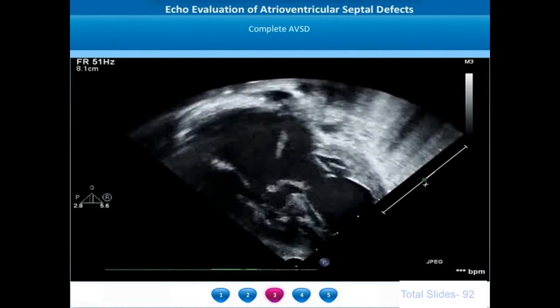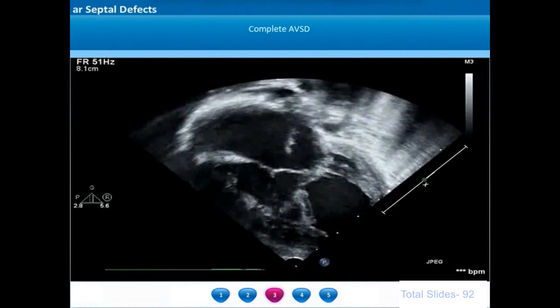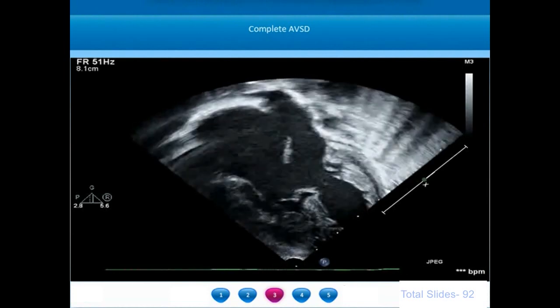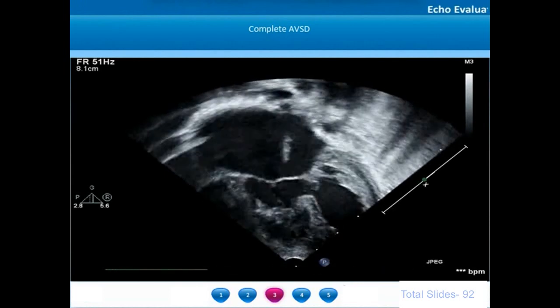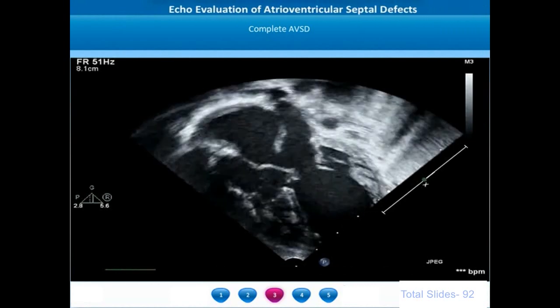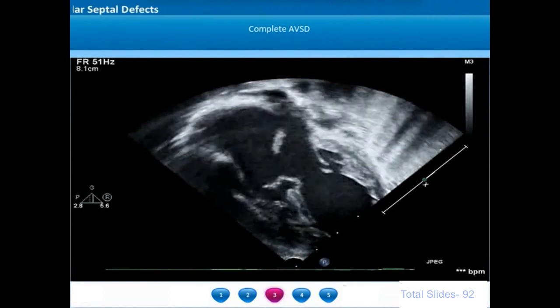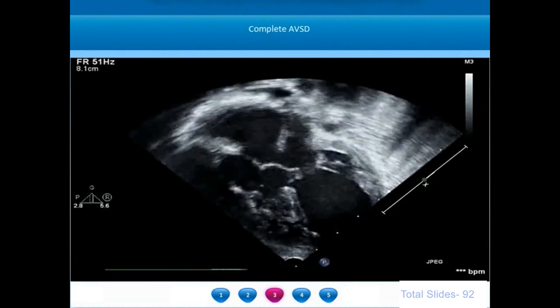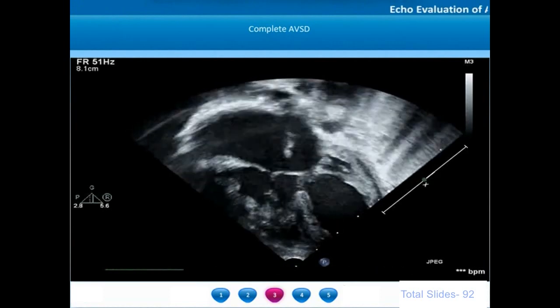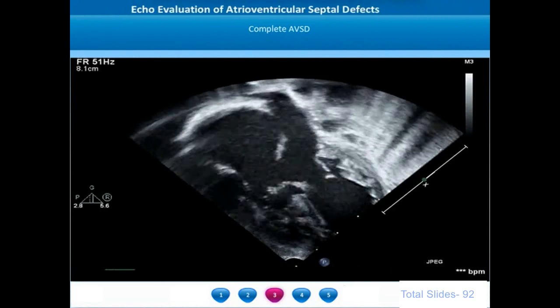Apical four-chamber view of a complete AV septal defect shows a large inlet ventricular septal defect. The two ventricles are nearly symmetrical, so this is a balanced AV septal defect. Right ventricular hypertrophy is a common feature because the right ventricle sustains nearly systemic pulmonary artery pressures. We can appreciate the bridging leaflet cordae getting attached to the crest of the interventricular septum. There is in addition a small mid-muscular VSD.